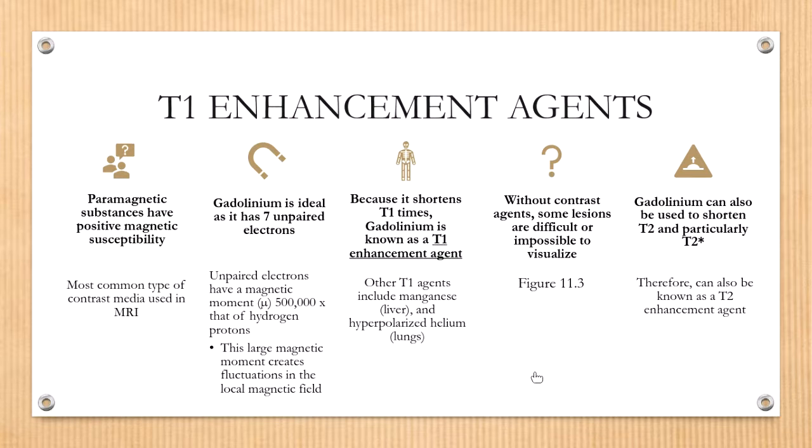Now, we can already tell based on the pathology that there's something going on because it doesn't look right. But then once we inject the patient with contrast, not only does that bottom lesion appear brighter in that bottom left picture, axial T1 single dose, but you also notice that there's yet another lesion in the left frontal hemisphere area. And we did not see that on the axial T1 without contrast enhancement.